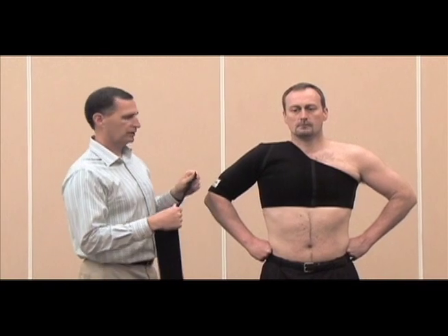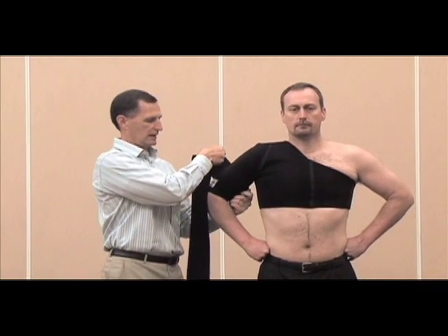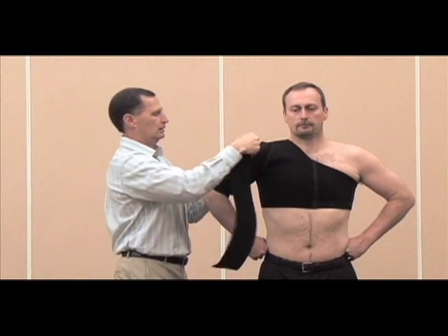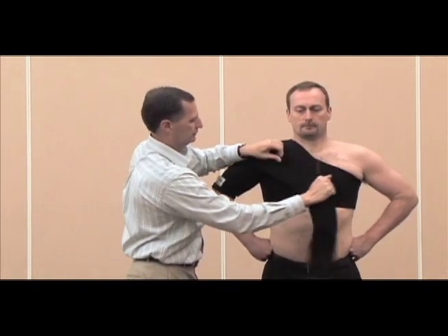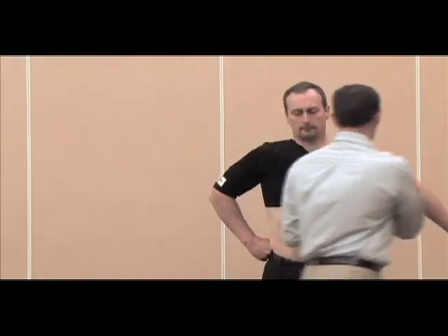Once in a while you'll run into an athlete with a strained pec. Once the body is applied, take one of the four-inch straps, start in internal rotation, come across the front of the shoulder, just fall in line with the pec, and secure it to the opposite side. That's to assist the pec.